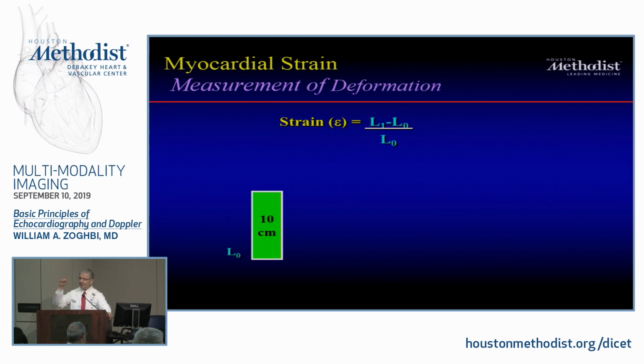I look at thickening of the septum and the posterior wall. That's what I could measure. The lateral walls, how am I going to do that? I couldn't do it. From the apical window, I couldn't do anything to look at thickening. You had to measure the whole ventricle and all that stuff. And so now you could look at deformation from any angle.